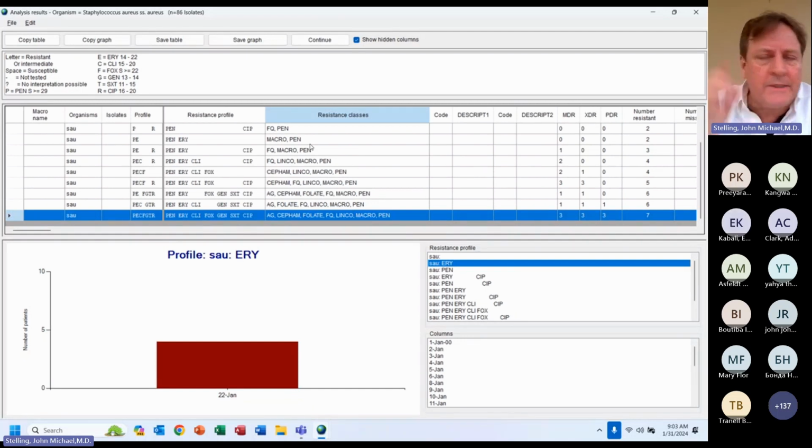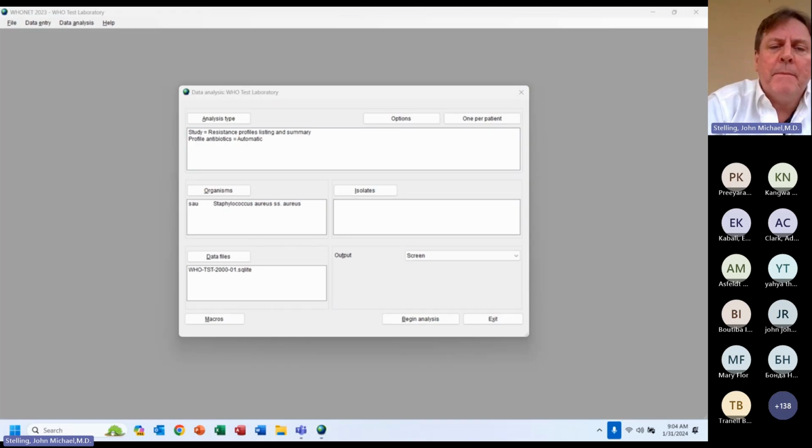People ask much more often about antibiograms. If you're a national coordinator and some of your laboratories test imipenem and some test meropenem, it would be nice if we could average them together. Or if some test cefotaxime and some test ceftriaxone. So in WHONET, we have partially implemented classes and subclasses, but we're a tiny development team and we just haven't had time to do that. So yes, the answer is that it will be possible once we get to it.